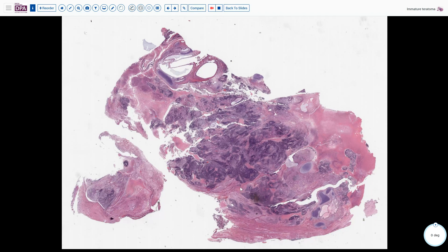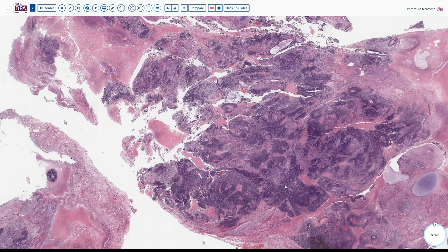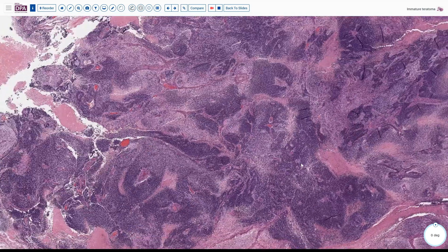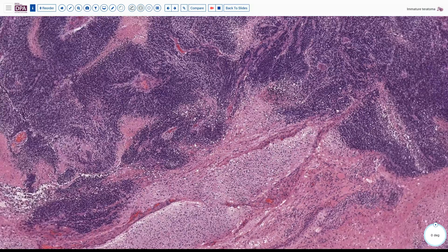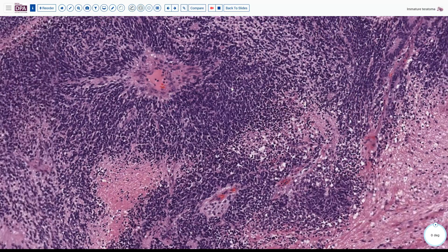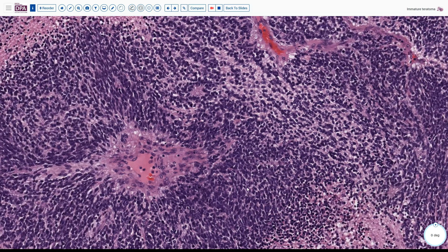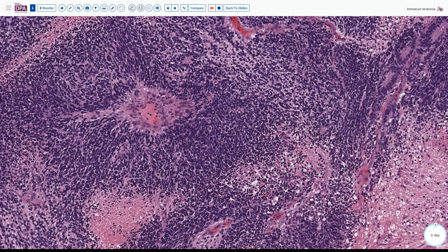At low power, this is obviously of concern because it's so blue. We can see some blue cartilaginous tissue. We also see areas of necrosis, as well as more mature different elements. But all of this blue tissue raises consideration for an immature teratoma, since this is most likely glial-type tissue. As we come into higher magnification, we can see that these cells are forming occasional little rosette-like structures — here we see one nicely with a little pseudorosette — and they're markedly accentuating around vasculature with associated areas of necrosis.